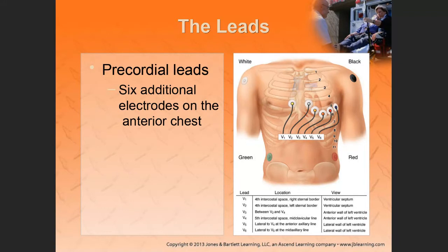Now, we're doing a 12 lead ECG. When you're doing a 12 lead ECG, which electrodes would look at the right side of the heart? That's the first question.